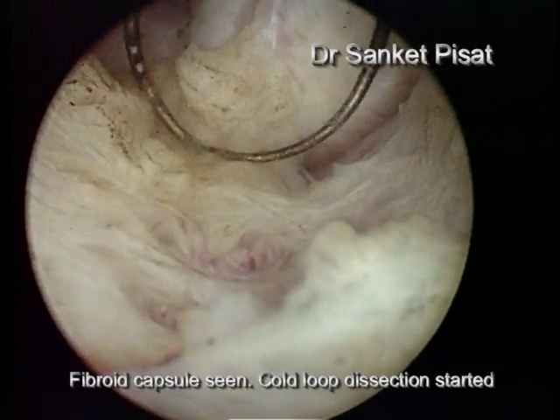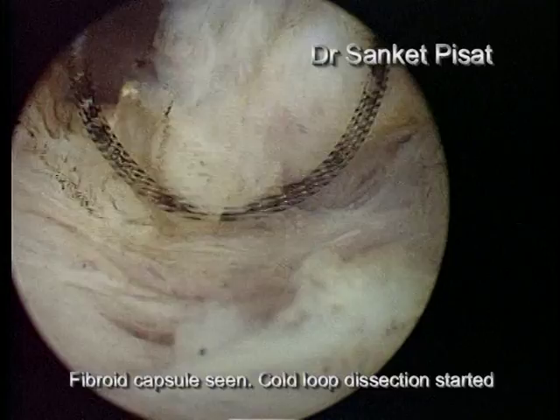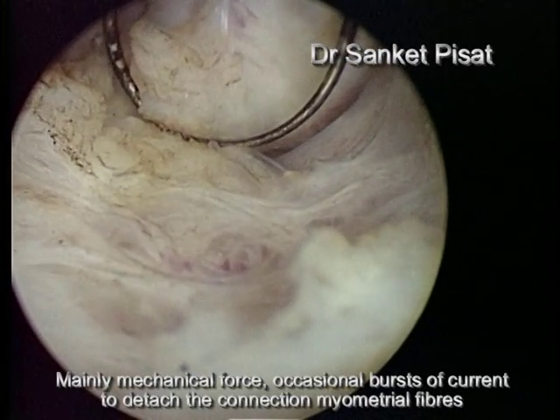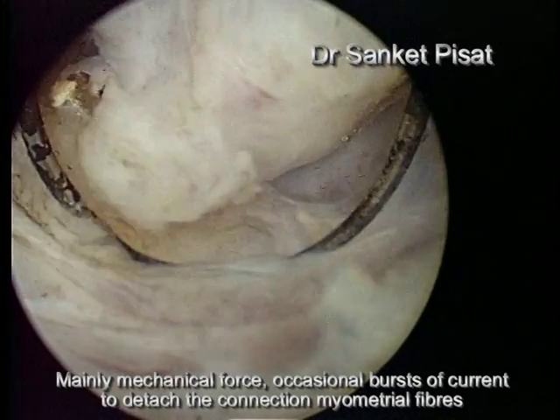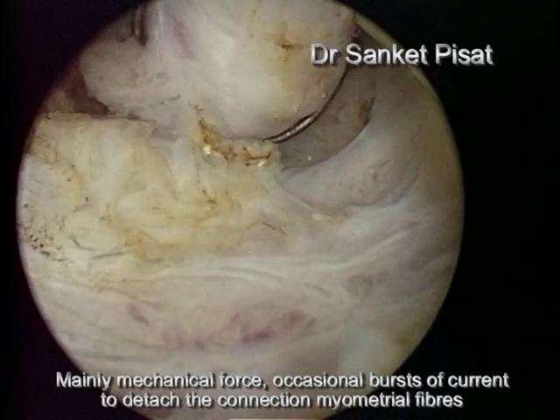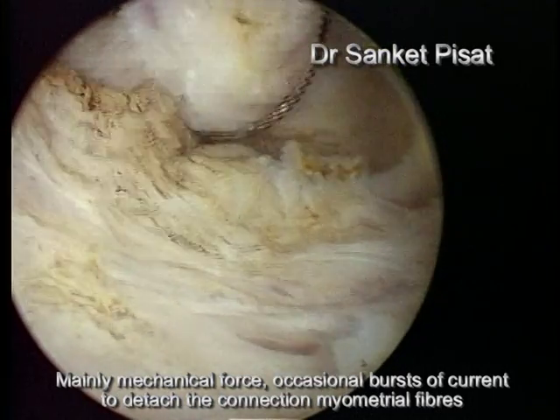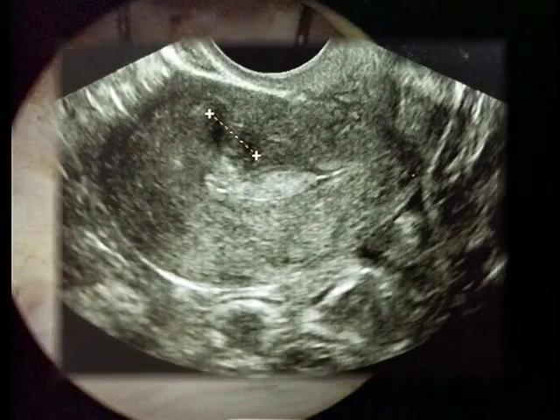Using this technique, the myoma is gradually peeled off from its attachment to the normal myometrium. Using this technique, the risk of perforation is minimized, and also the risk of thermal damage to the surrounding endometrium is minimal. Here, the fibroid is seen to be completely detached from its base.